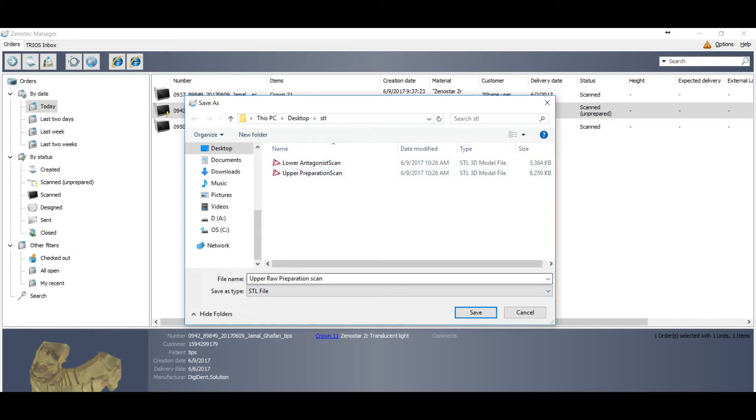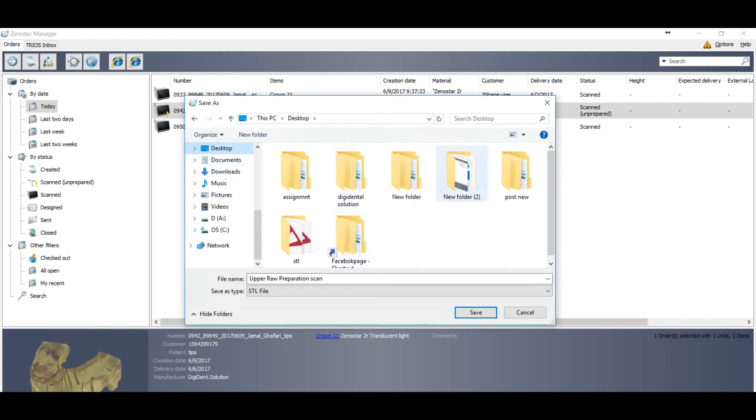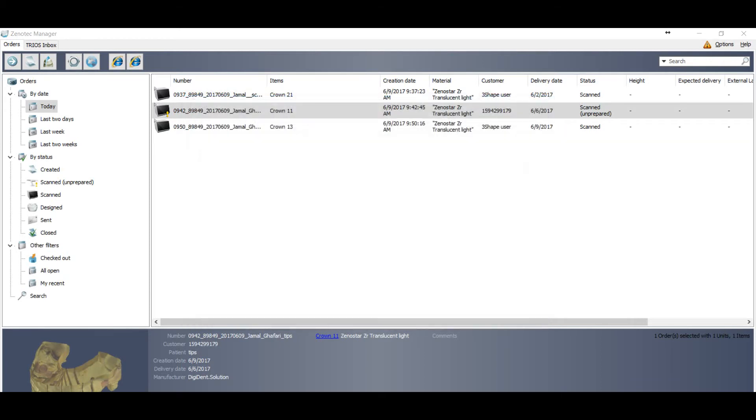You want to save as the STL, you can select as the STL. You can see you have already two save files there, so you can just save it another way.